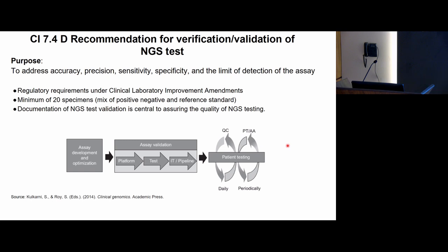Yeah, so firstly we look at ACMG only if we are doubting a germline inheritance. So if it's close to 50%, 40%, 50%, then only we start looking at ACMG. So what AMP does is look at somatic mutations and clinical importance for that gene. So it could be a gene that could be pathogenic, but it may not be somatically important in that particular disease context. So we have had a lot of discussion about that.